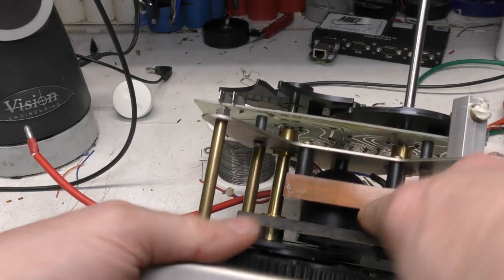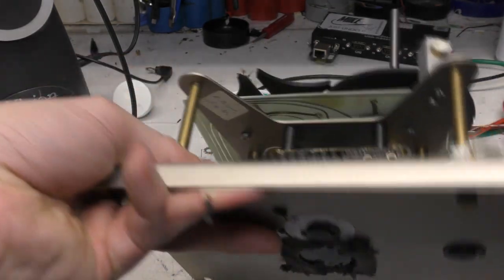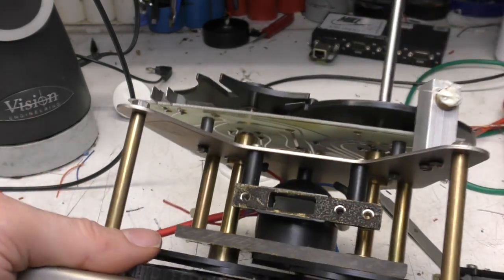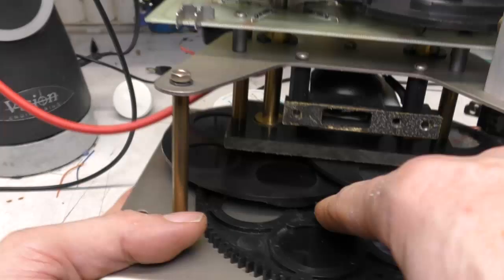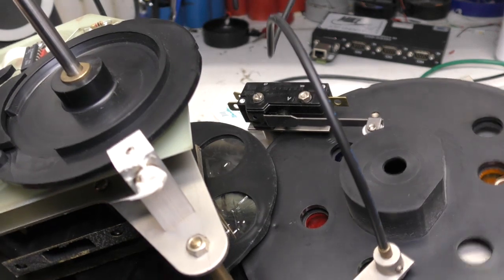And in this enclosure, we've got the flash tube assembly. The tube sits in there, and there's a little, I can't see if that's actually reflective or just white. They might have to use white to make sure the reflection's nice and diffuse, so that again goes through the colour wheel and then the two density wheels. So this one at the bottom here, this is the colour wheel.